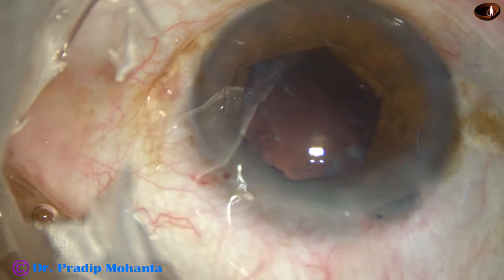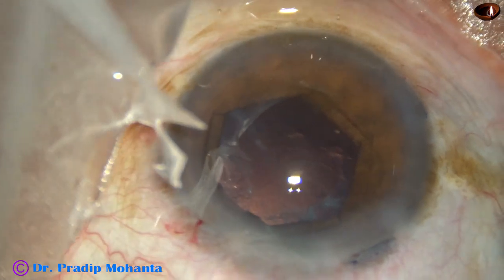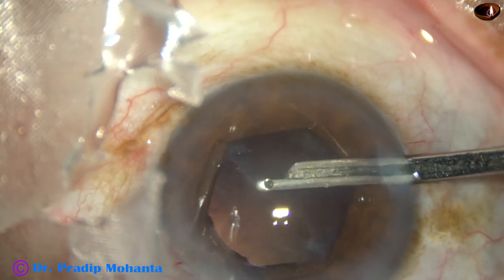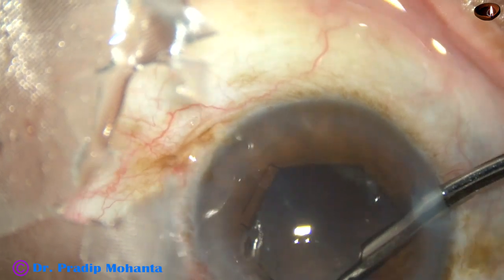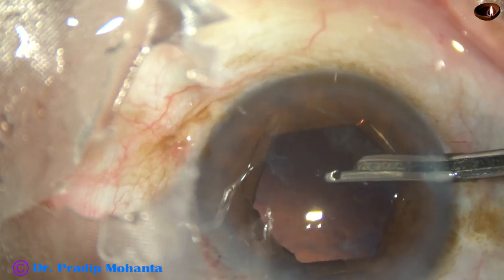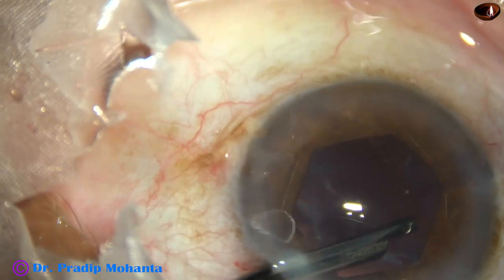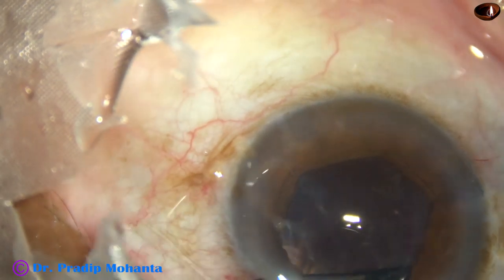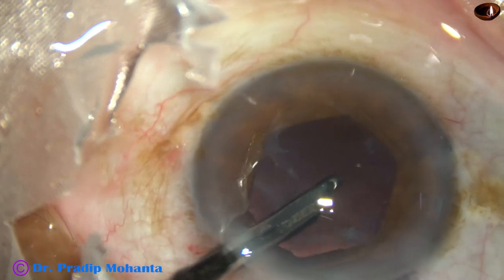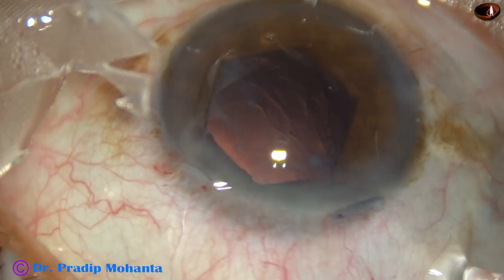Cortical cleanup is done. Viscoelastic substance is injected into the anterior chamber, and then cortical cleanup is performed going through the side ports. This is a 23G Simcoe cannula — one can use bimanual irrigation-aspiration. Thorough cleaning of cortex is done. There is some fibrosis of the posterior capsule, but the central area is clear and the posterior capsule is intact, nicely protected.